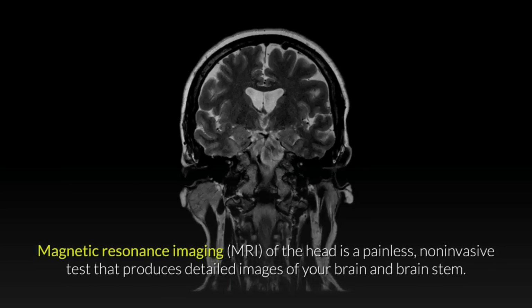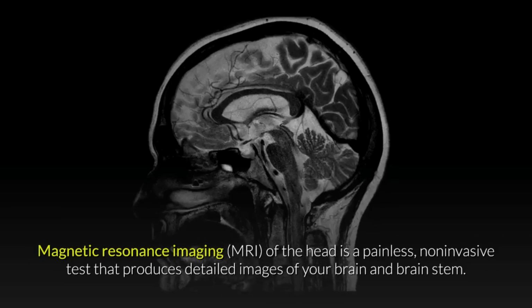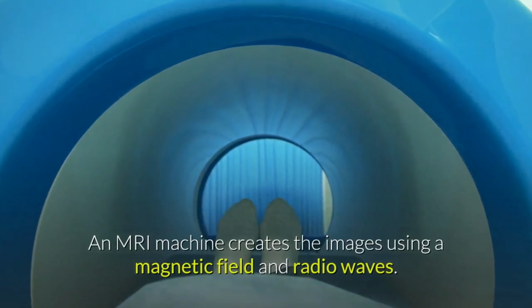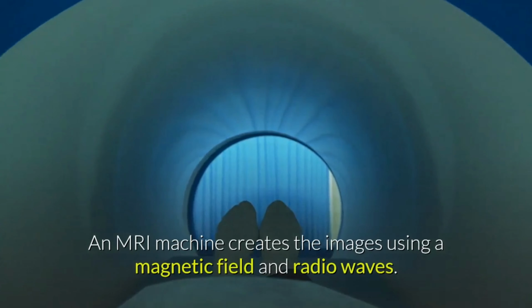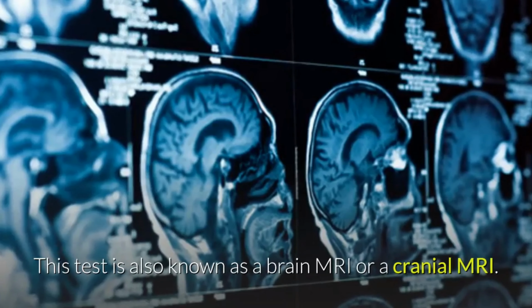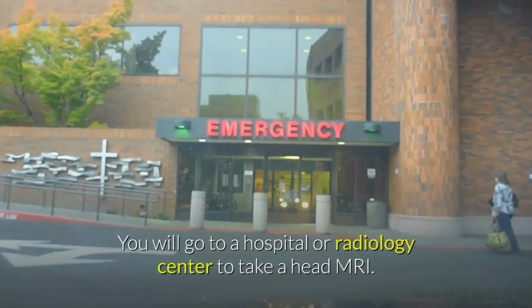Magnetic resonance imaging (MRI) of the head is a painless, non-invasive test that produces detailed images of your brain and brain stem. An MRI machine creates the images using a magnetic field and radio waves. This test is also known as a brain MRI or a cranial MRI. You will go to a hospital or radiology center to take a head MRI.